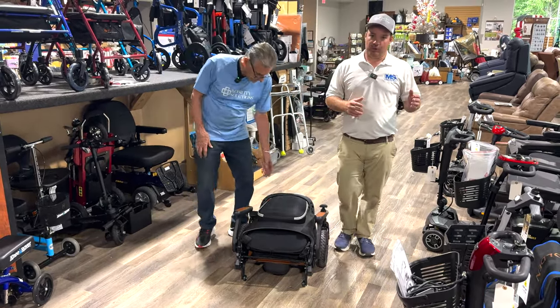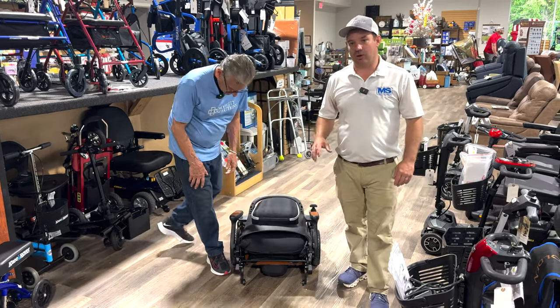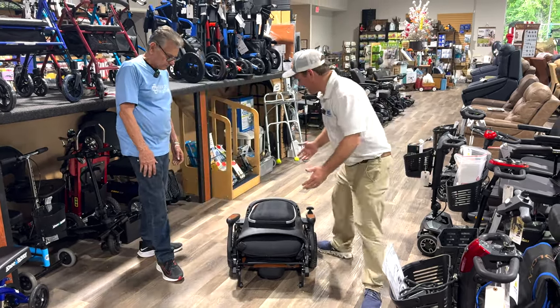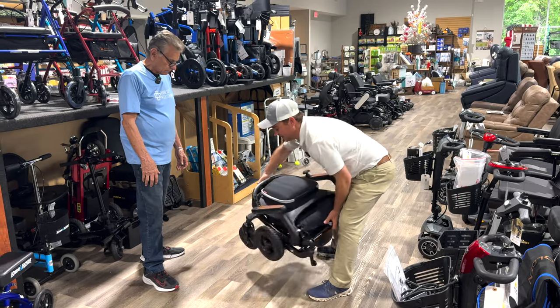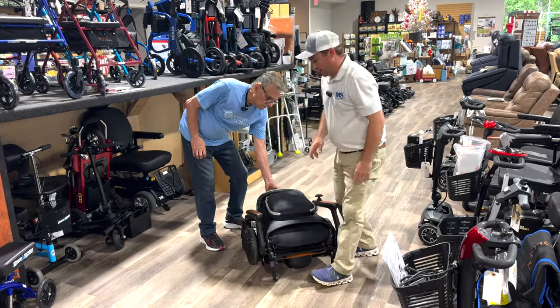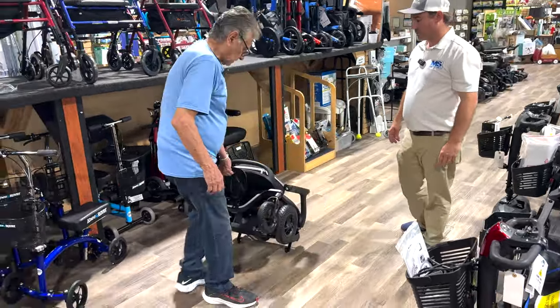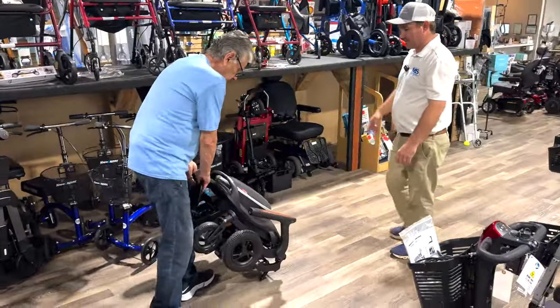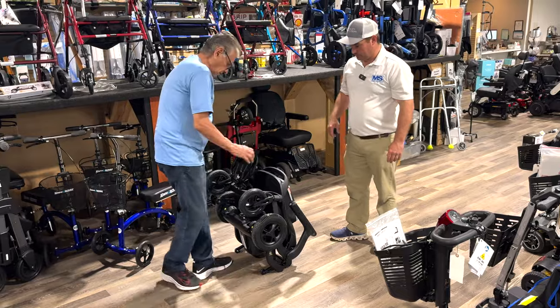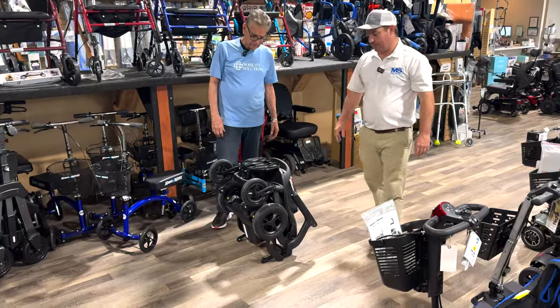The other really good fold-up chair is the Whill. I'm not a big fan of it. I think it's a little overweight and awkward to pick up. This is actually very convenient to pick up. So you can roll it. Oh, yeah. Can you stand it straight up? Oh yeah. Stand it straight up, put this in the closet. Traveling.